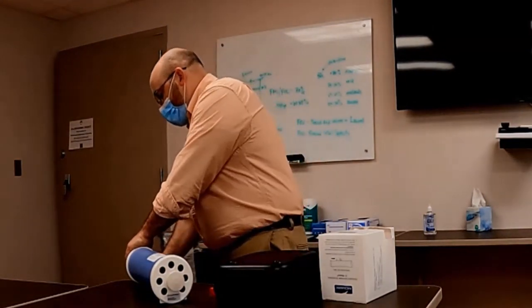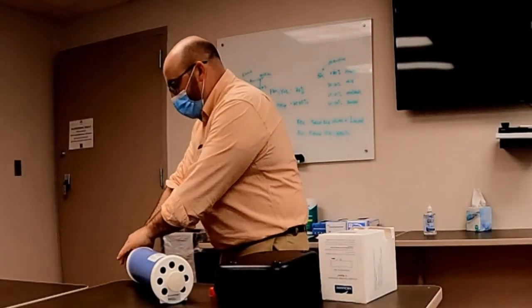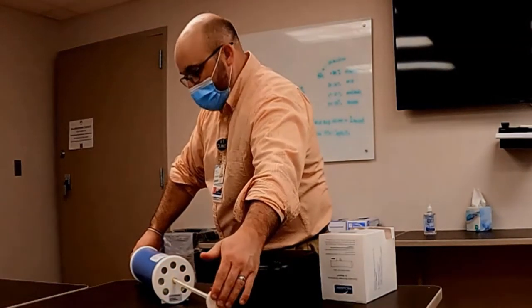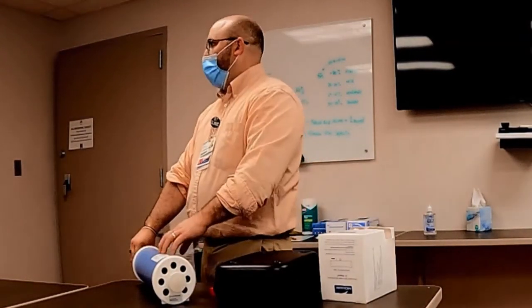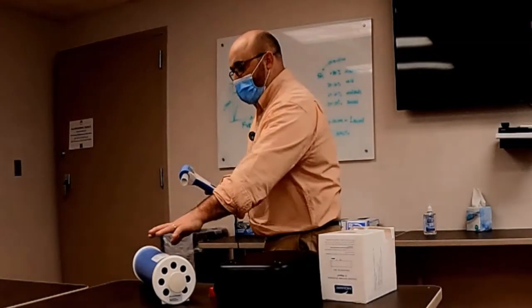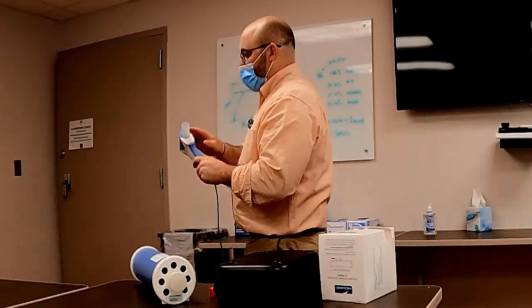This thing goes on here. If you plugged in, you would go through the calibration on the computer, and then it would probably ask you to open it all the way up until it stops. Close it down, open it up, and close it down, and that will probably be it. That's calibration. So it's just checking to make sure that when this says 3 liters, it's going through here, going to the computer saying 3 liters.